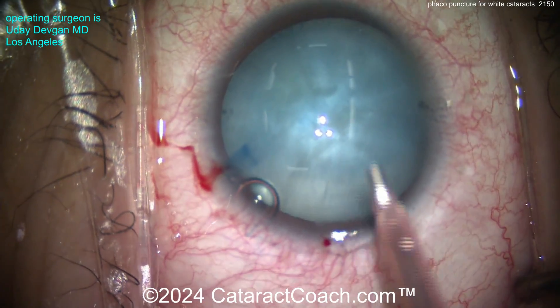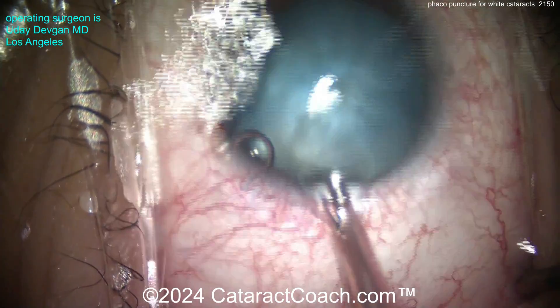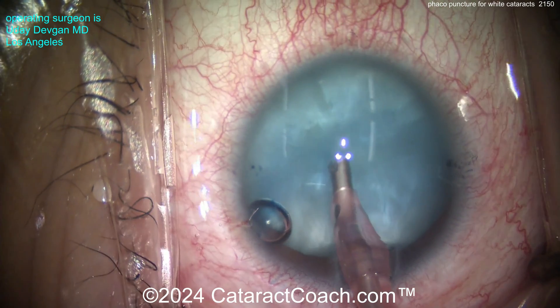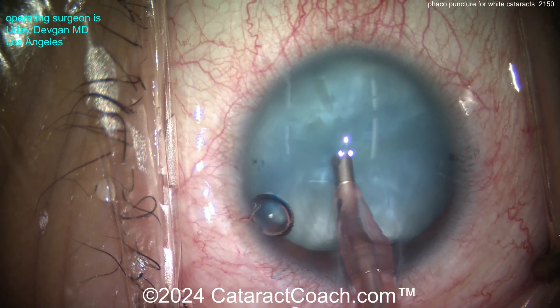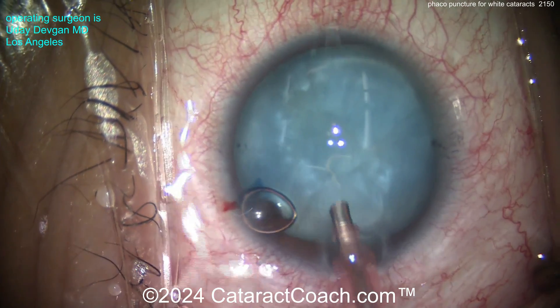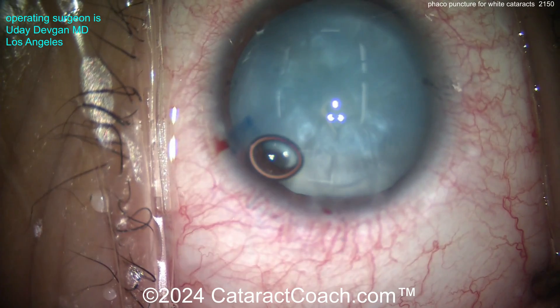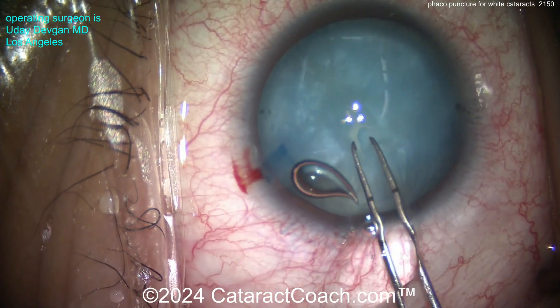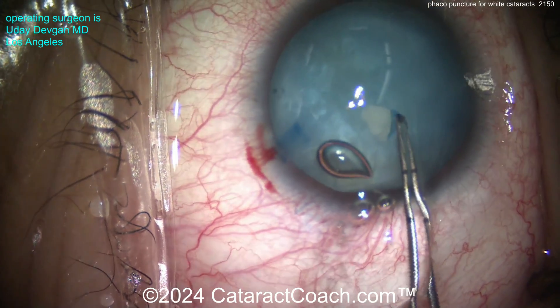Getting back to this case: the idea is to use a single burst mode on your phaco machine. One burst, 10 or 20 milliseconds, bevel down right there in the center, and a little burst with a little bit of aspiration. Low aspiration — only about 100 or 200 millimeters of mercury of vacuum at the most. Low flow rate: 20 cc's a minute or less.